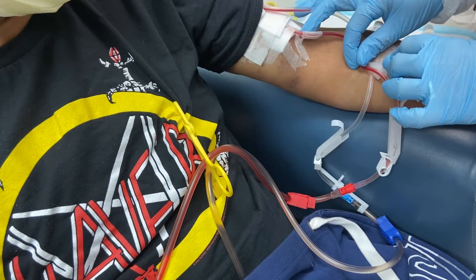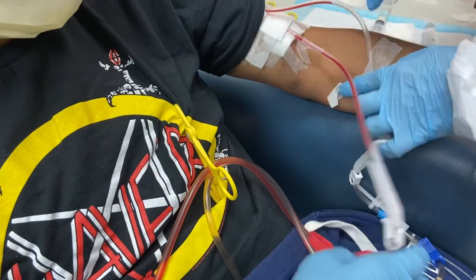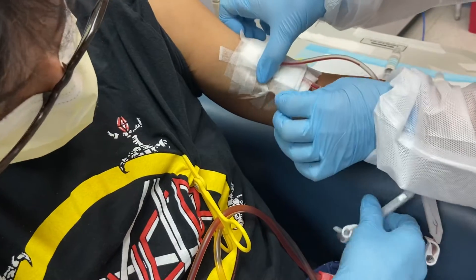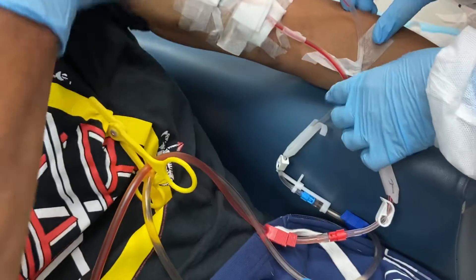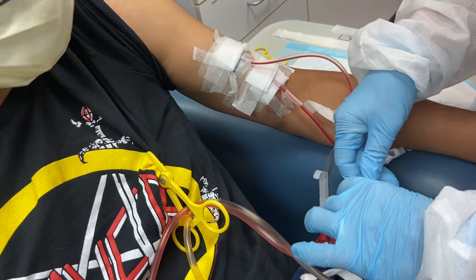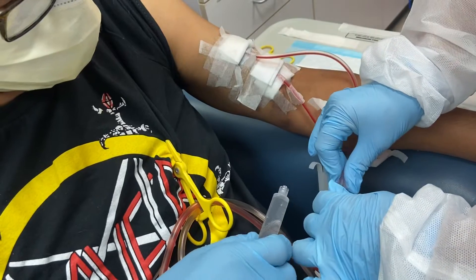Disconnect the arterial. Arterial here, Evelyn. Disconnect from here. I'm not doing the tape yet. You got your syringe ready?